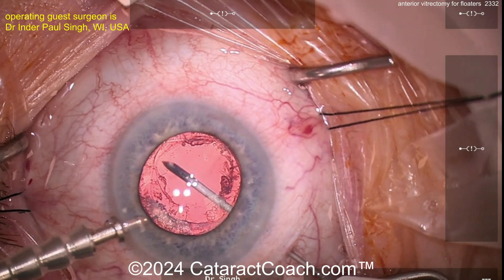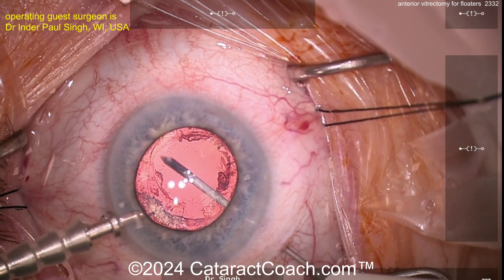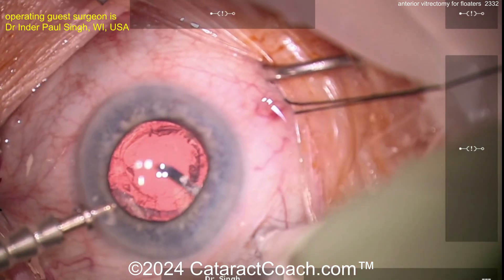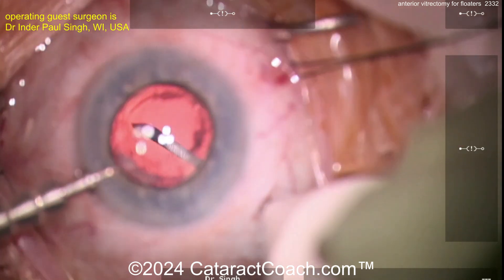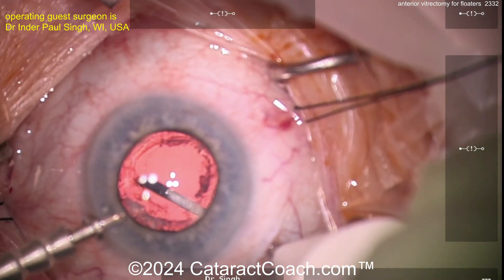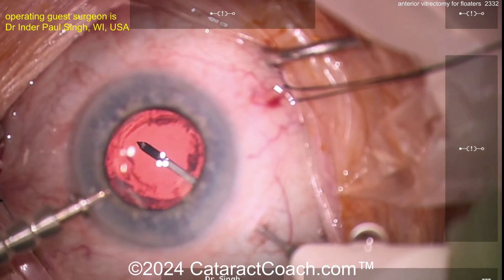Now I'm going a little more posteriorly towards the middle — again holding it steady, not pulling and tugging, not moving it around. As I fast-forward, going all the way down to the middle. This needle tip is not long enough to go hit the other side of the wall or hit the posterior pole — it's too short. Therefore we're really staying in the middle of the vitreous, not moving around.